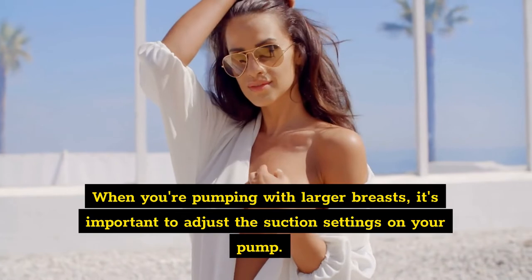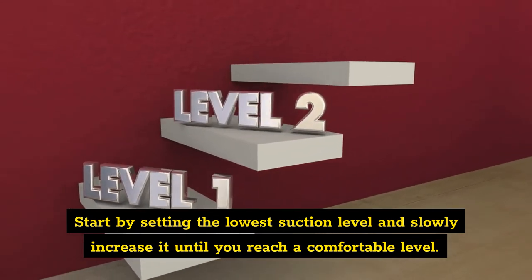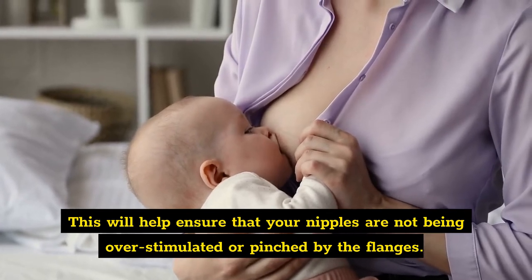One: adjust the suction settings. When you're pumping with larger breasts, it's important to adjust the suction settings on your pump. Start by setting the lowest suction level and slowly increase it until you reach a comfortable level. This will help ensure that your nipples are not being overstimulated or pinched by the flanges.